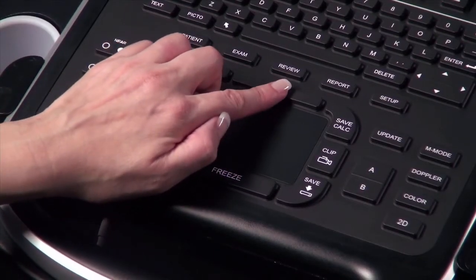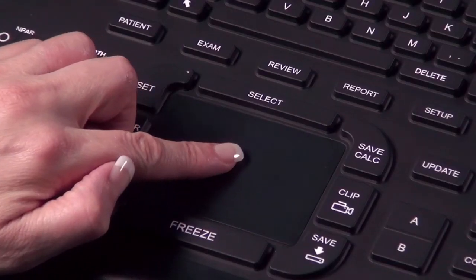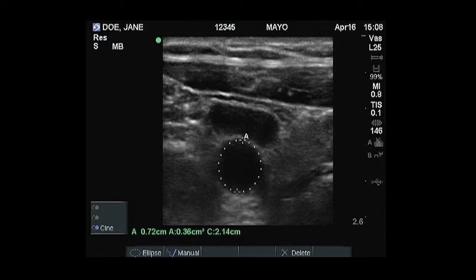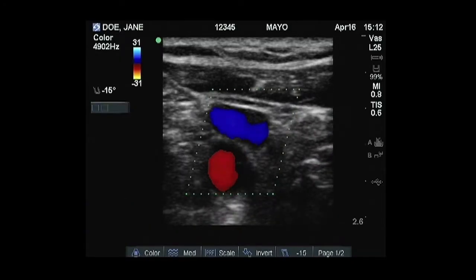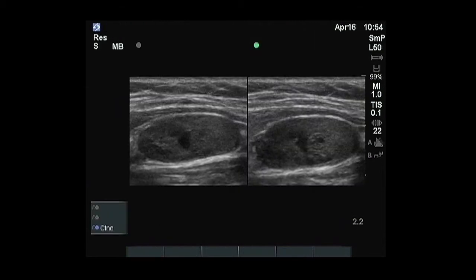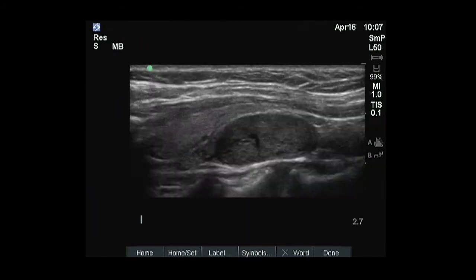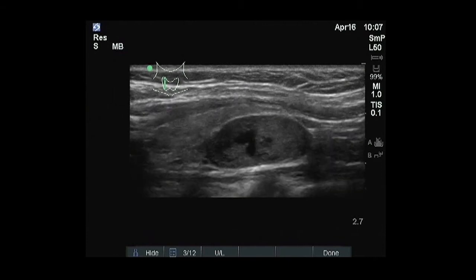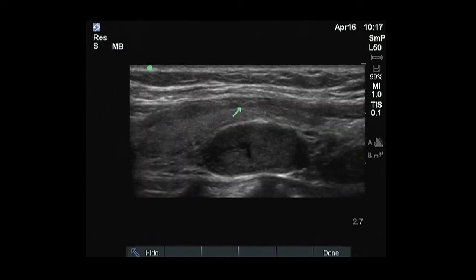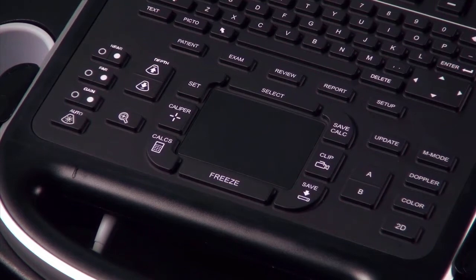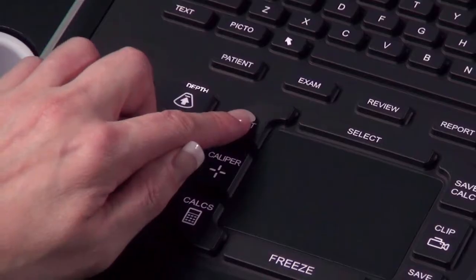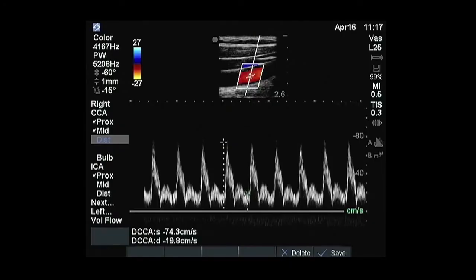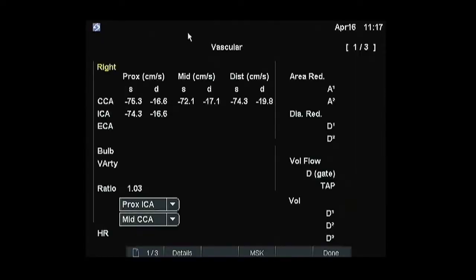The select key is used to make various choices depending upon the function that is activated. It is used to switch between calipers for measurement, selections on color and Doppler menus, frozen images in duplex and dual screens, pictograph marker position, and arrow position or orientation. There are two functions on either side of the trackpad: set and save calc. The set key confirms caliper location for measurements. The save calc key transfers the measurement to the patient report.